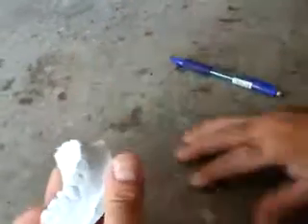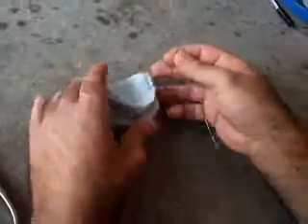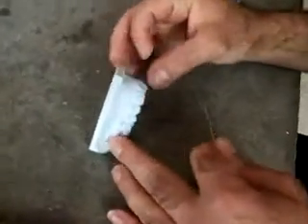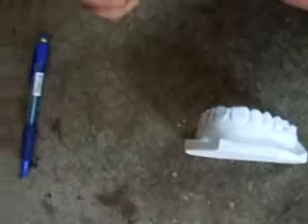Now the wire should fit by 100% directly to all teeth. We apply tension for it with the labial bow.